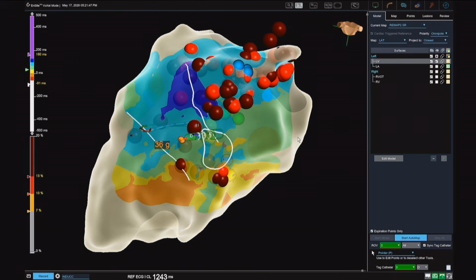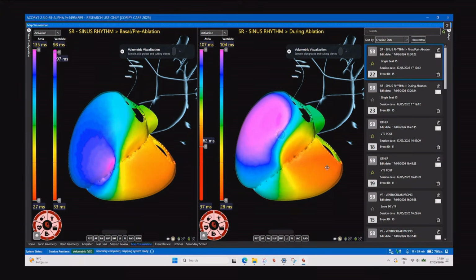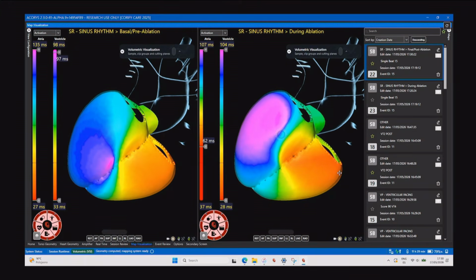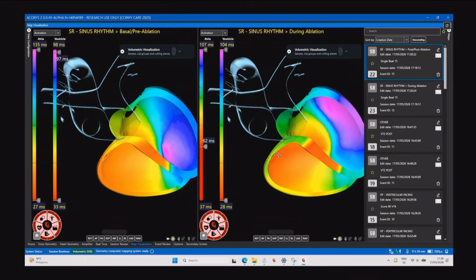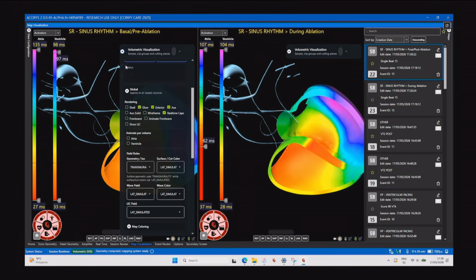And if we can move to the ECGI, remember that we are working in the ECGI remap. It's not there yet, but if you can show it from another view, Esther, please. Okay, like this. On the left, can you propagate the first one? This was the basal map.